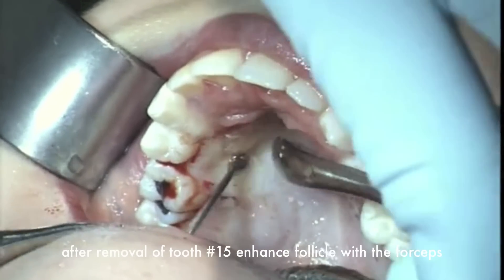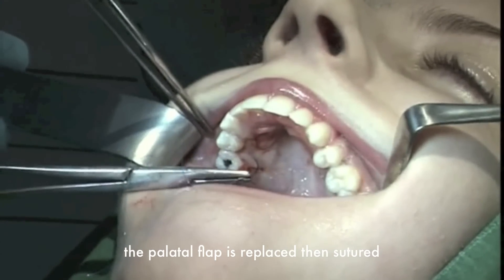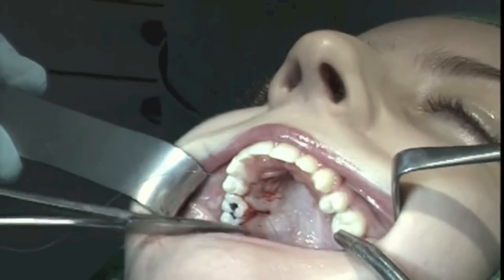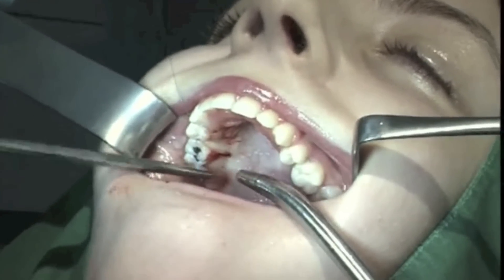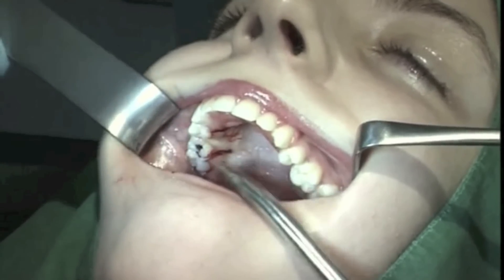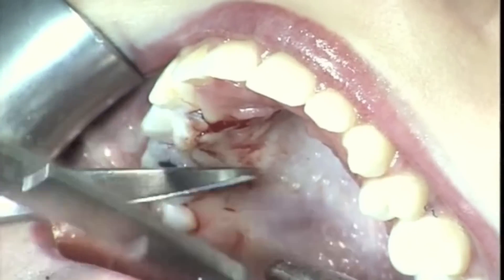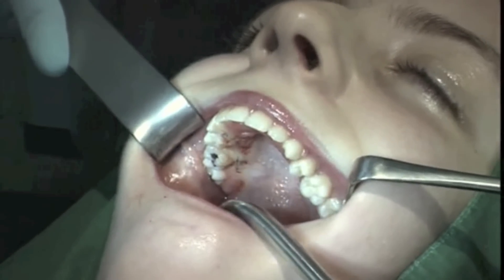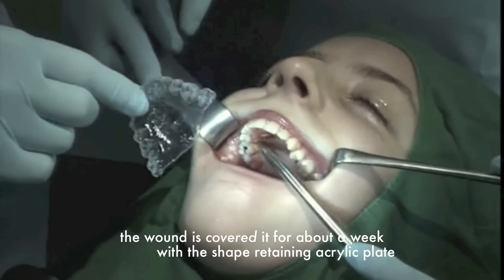After removal of tooth 1-5 and its follicle with the forceps, the palatal flap is replaced and sutured. The wound is then covered for about a week with a shape-retaining acrylic plate.